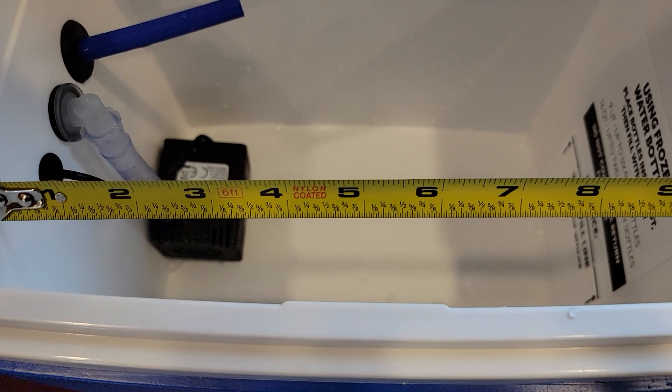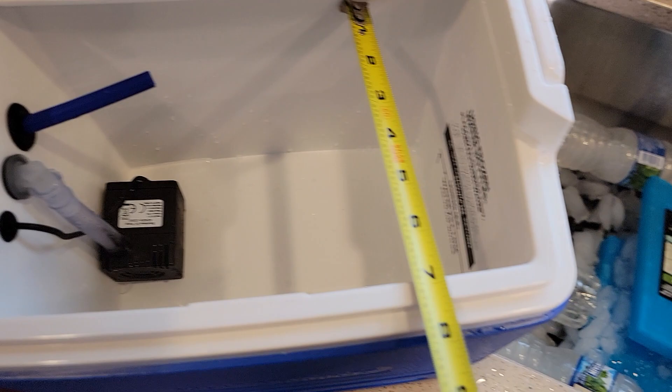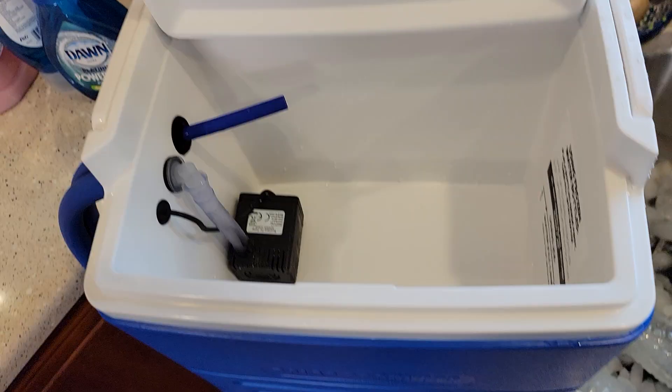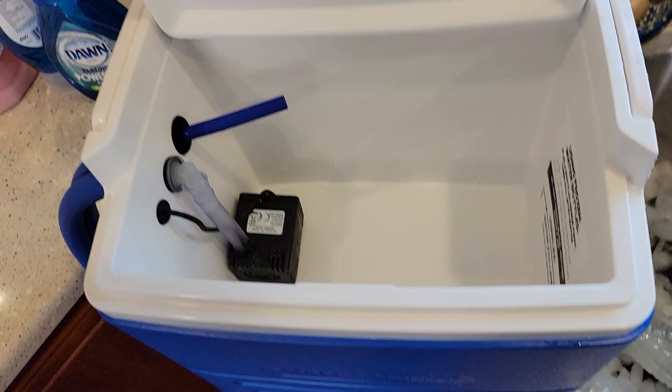Let's do some dimensions on the cooler. There's that water pump. This is overall right around 10 inches. Front to back is about six and three quarters inches. The water line is right around the three inch mark, and all the way to the top is about seven and a half inches. This has really been helping. This would be very good after a knee operation — I'm using it for my elbow, which has been having some pain lately. I hope this video helps. Thanks everybody for watching.